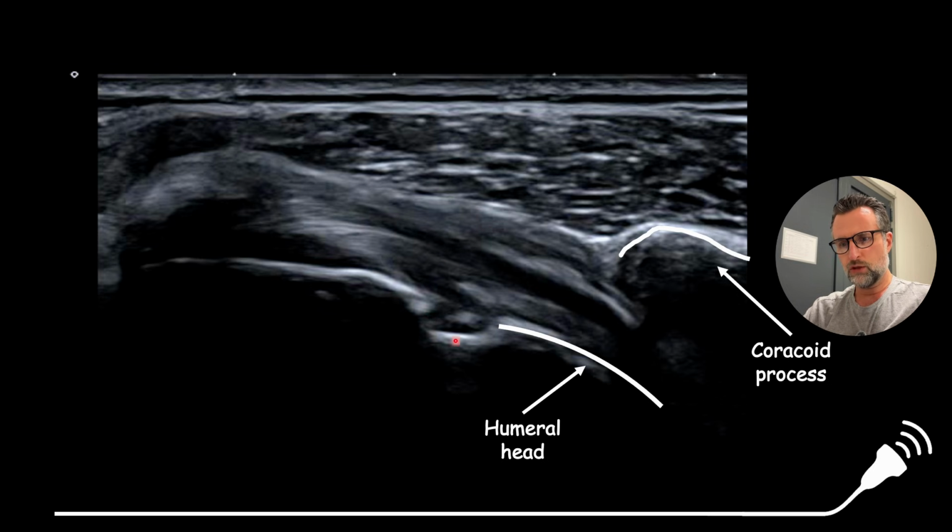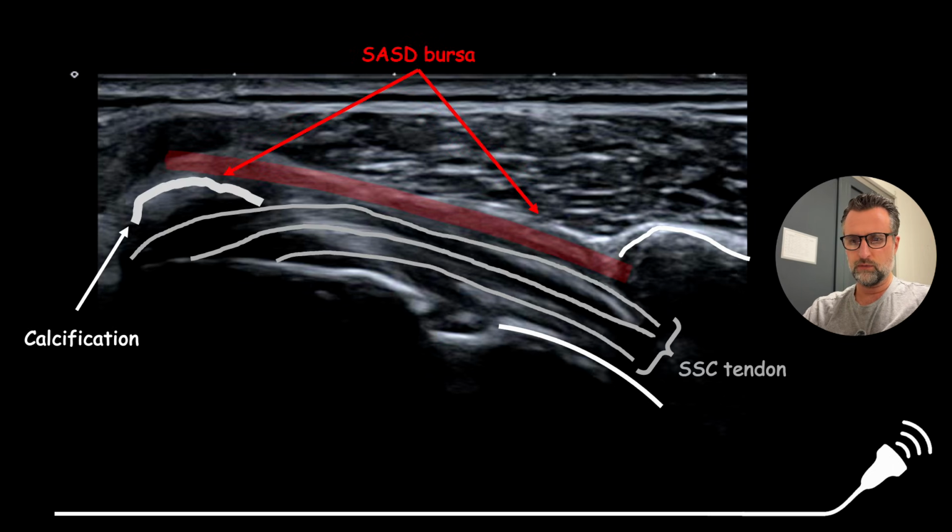One more thing to note is this bony irregularity right here, which is right between the end of the humeral head and the cartilage, and here the footprint, and in between these kind of irregularities are normal, and they are called herniation pits. Here I have also marked the tendon, and here you see the calcification, and overlying this tendon is also the subacromial subdeltoid bursa.